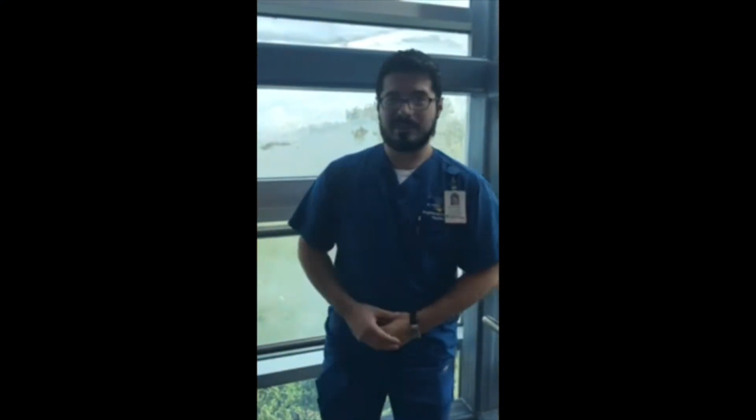Hello, we're going to be talking about EKGs today, also known as the ECG, which is short for the electrocardiogram. The electrocardiogram is a test that measures the electrical pathway and the activity in one single heartbeat. When taken over time, we can see a clear description of what is going on inside the heart. This is done because the electrical pathway runs through every tissue of the heart.